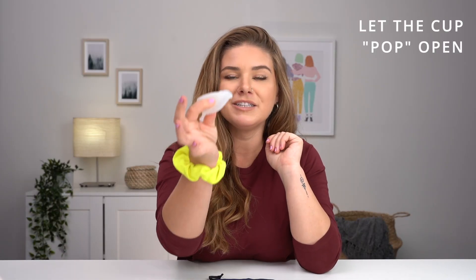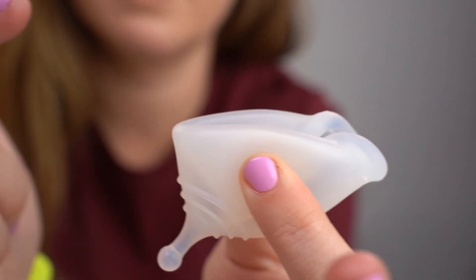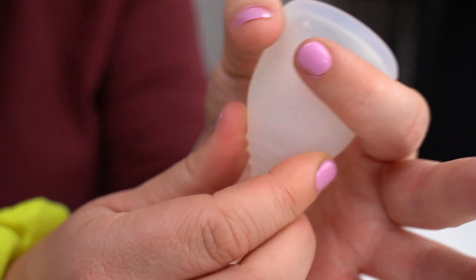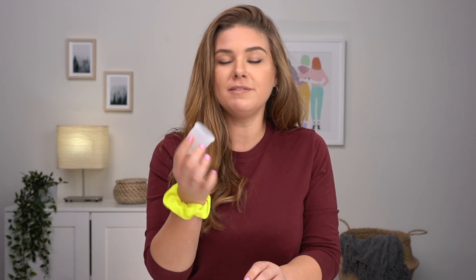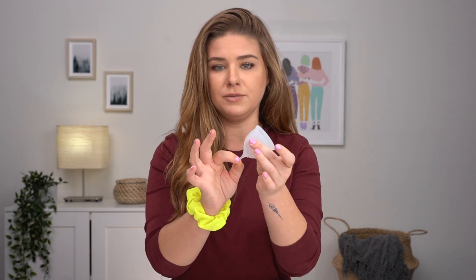So for step four: with your fold ready, you can put it all the way in with your fingers, but in the beginning that might be a little intimidating, so you can just bring it to this little peak right here and let it pop open. Sometimes it won't open up all the way, which is totally okay — you can just squeeze the base and it will open up. With harder cups you may feel or hear it pop open, and with softer ones you might not, which is fine — just pull the stem and make sure the seal has formed.